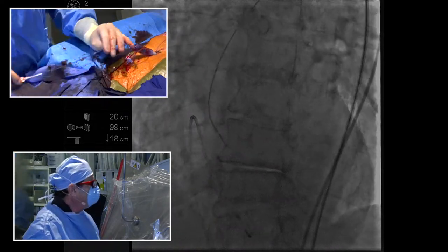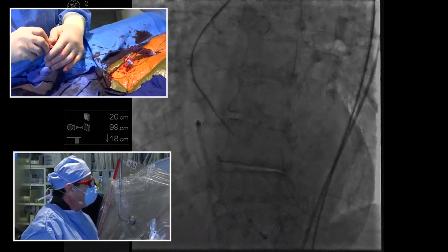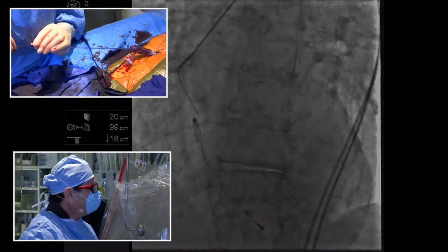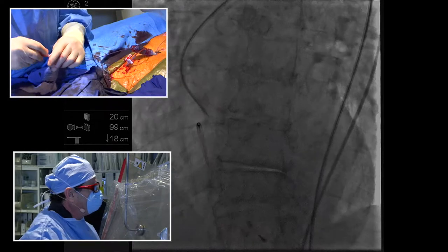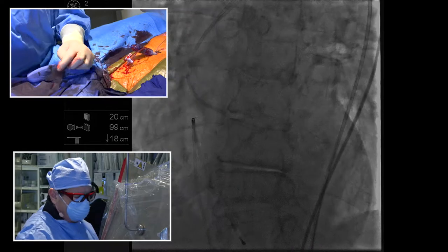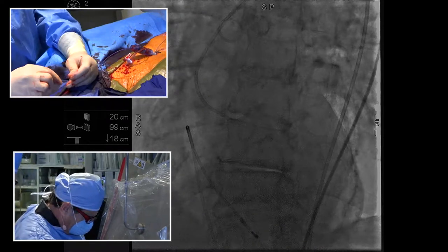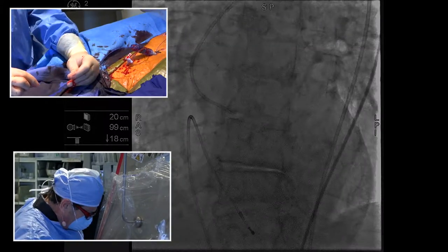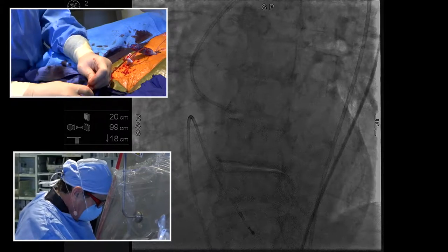That's the wire. Right, we'll try the wire. That's what I wanted next. So just put some fluid in that wire, and we'll give it a try. This is annoying. Just you ready? Yep. Okay. That should go right through. Okay, so this one is a very lubricious wire, so it's hard for me to hold.